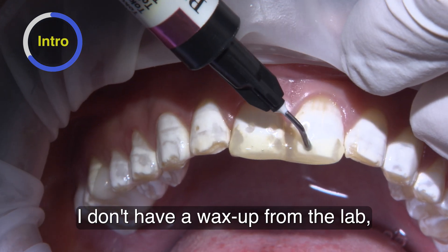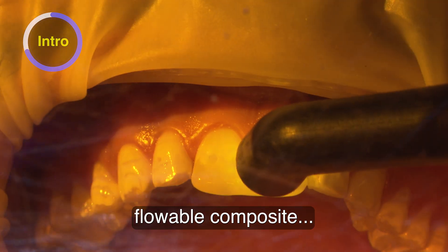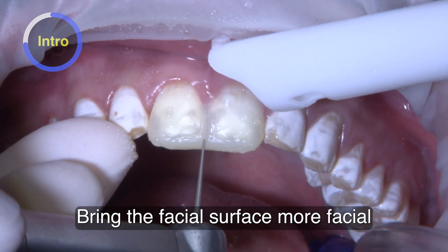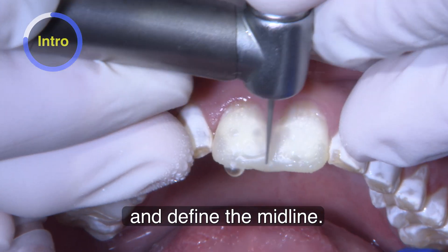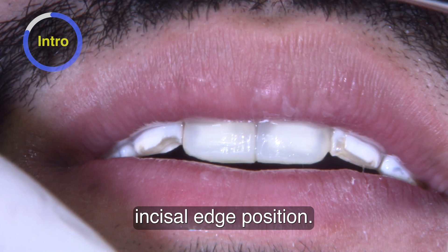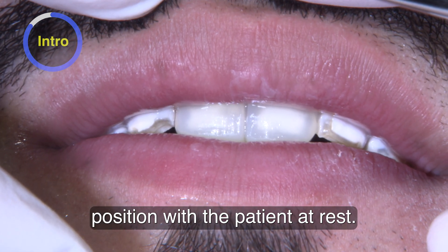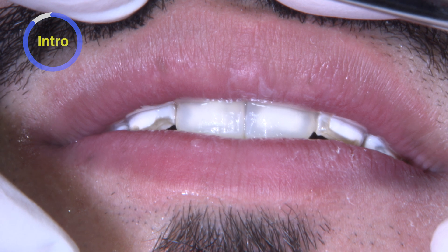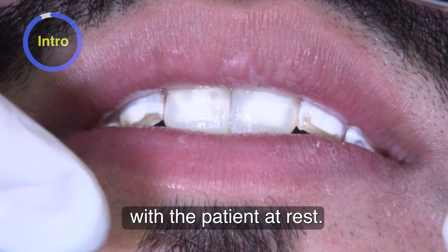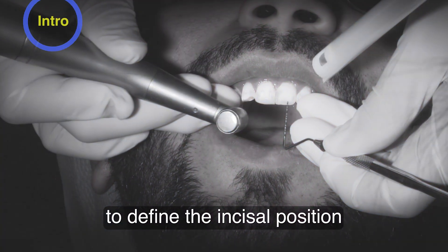I don't have a wax-up from the lab, so what I do is a chairside mock-up. Flowable composite to build the incisal, bring the facial surface more facial, and define the midline. Once I have the midline and incisal edge position, I evaluate the incisal edge position with the patient at rest — we're looking for two to three millimeters of incisal display with the patient at rest. That's what I use to define the incisal position for the patient.